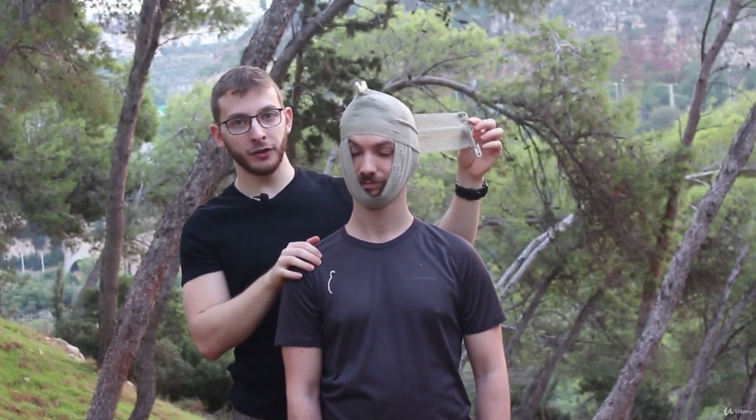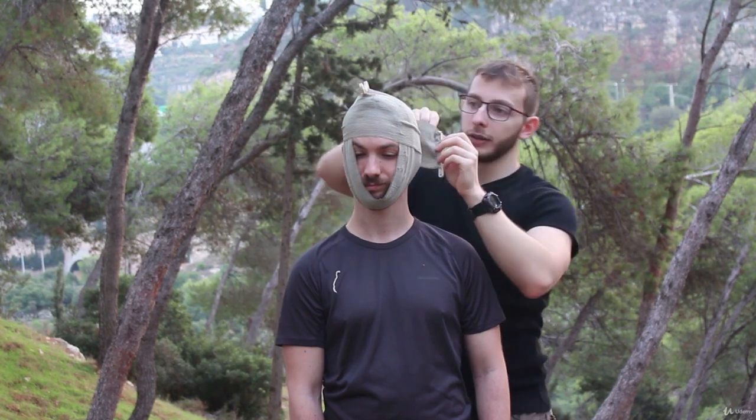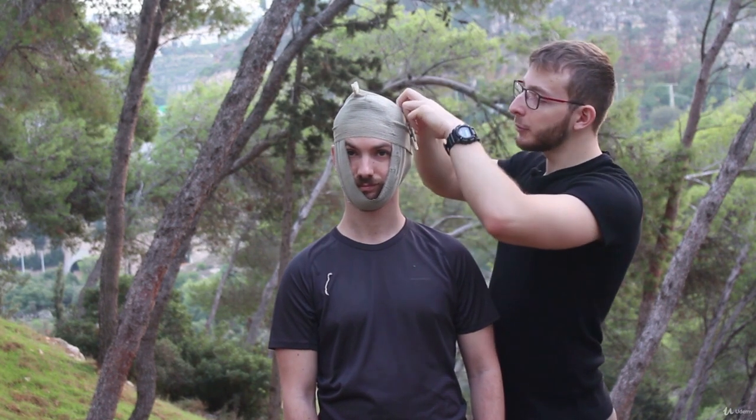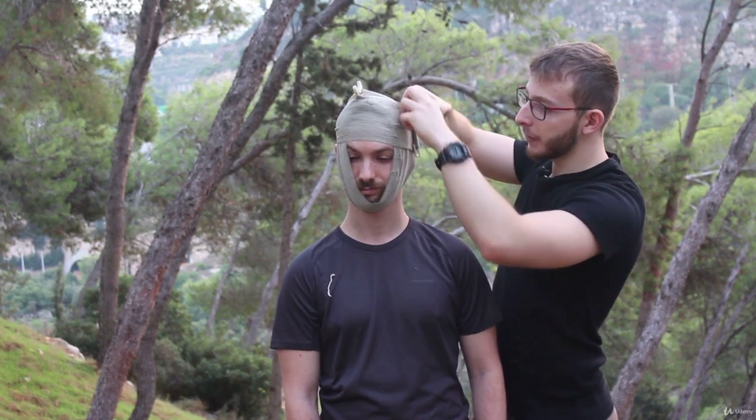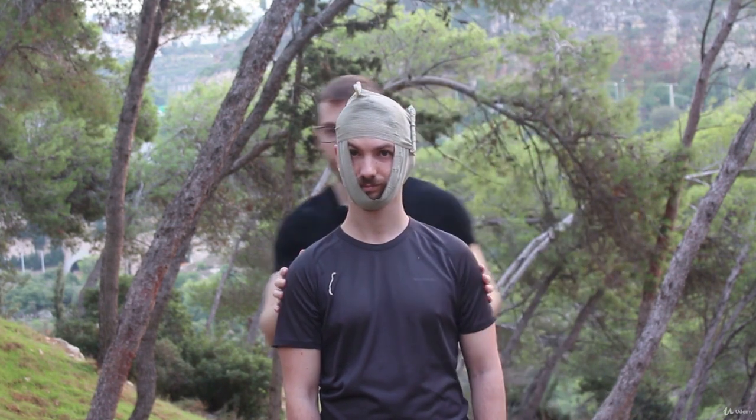When you're finished, you have the clip at the end, and you just want to clip to the side like we did last time. So above and below. Perfect. And that is how we use the Israeli bandage to bandage the head.